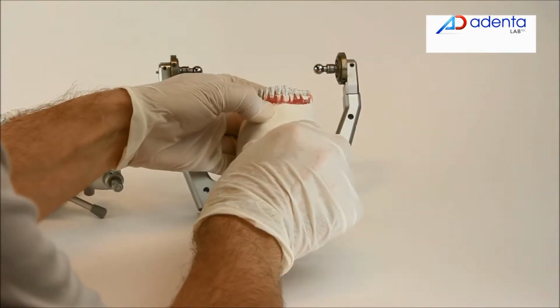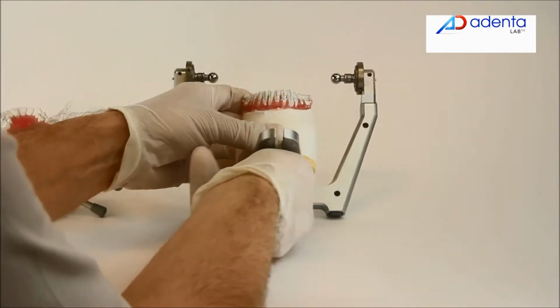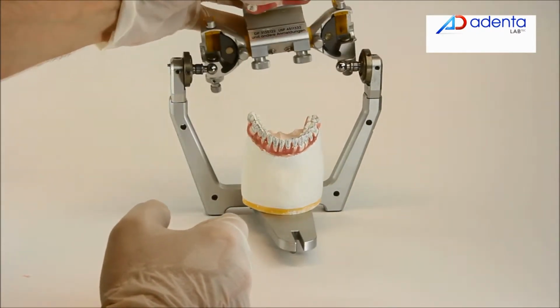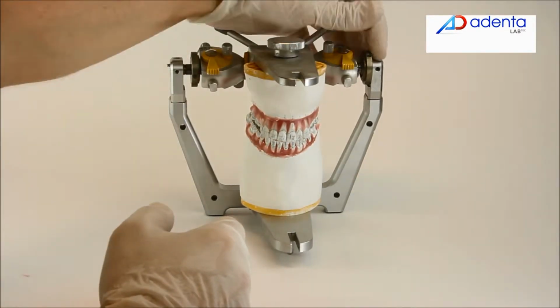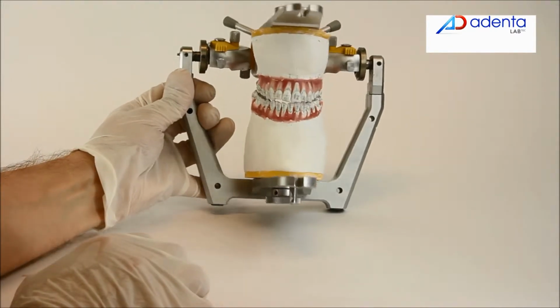When the occlusogram matches perfectly to the teeth position, the lower setup model correction is finished. Put the lower model back into the articulator. Check the occlusion with the upper model. Because the upper model is not corrected, they will not match.